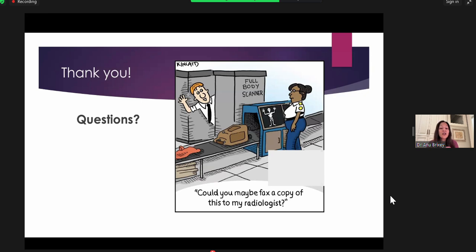So when you have acute right heart strain, your pulmonary artery is not going to enlarge. It takes a long time for your pulmonary artery to remodel and enlarge. And so when you see a very large pulmonary artery with what looks like right heart strain, this patient might have chronically elevated right heart pressures.